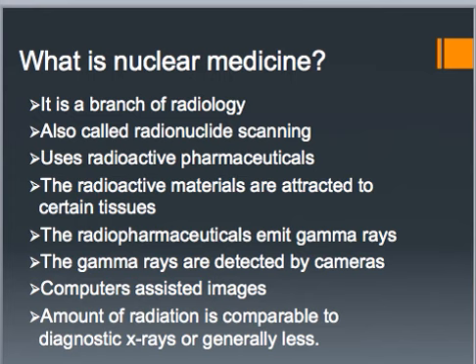So what is nuclear medicine? Nuclear medicine is essentially a branch of radiology. Sometimes it's referred to as radionuclide scanning, or a lot of times just nuke med, which is short for nuclear medicine. That's what I tend to refer to it as, just because it's short and easy. Nuclear medicine studies require the oral or IV introduction of very low levels of radioactive chemicals called radionuclides, or radiopharmaceuticals, or tracers. They use all the terms interchangeably. Those have to be introduced into the body for nuclear medicine to work.